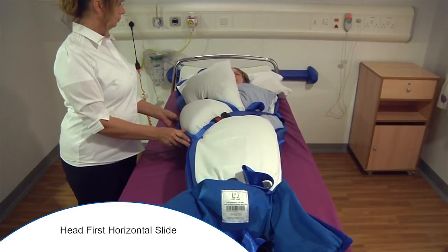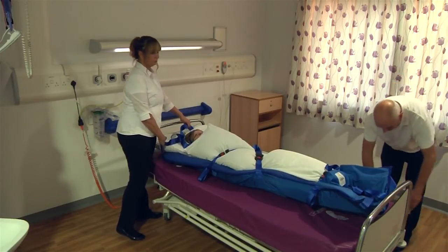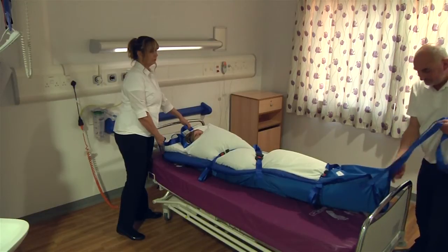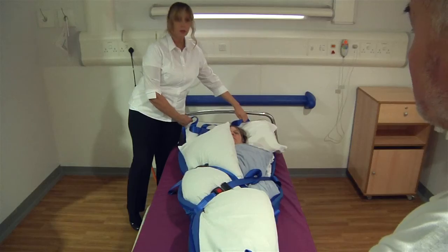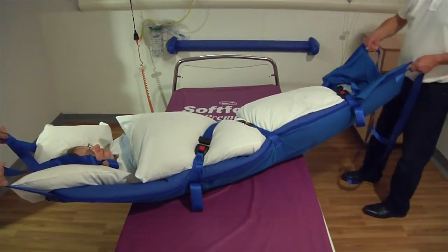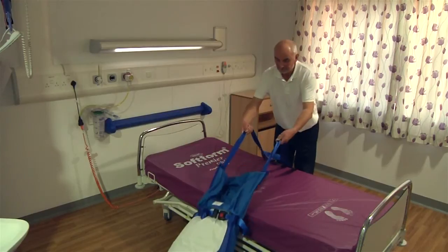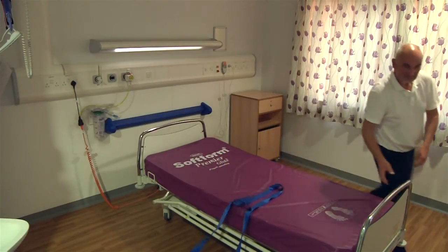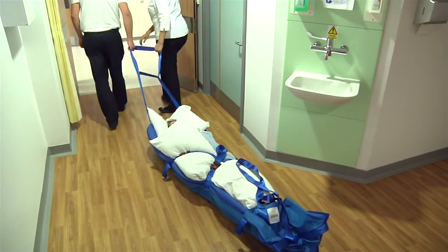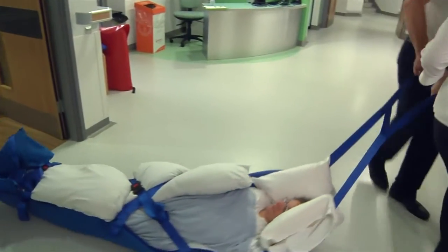With a handler at each end of the ski sled, take hold of the pulling straps and move the patient into a position where they are lying across the bed at approximately 90 degrees, ready to slide off. The person at the head end keeps the strap short and starts to move backwards, allowing the ski sled to touch the floor. The foot end operator allows the straps to move through their hands, controlling the descent of the ski sled onto the floor. Once the ski sled is on the floor, both operators should pull it from the same end.